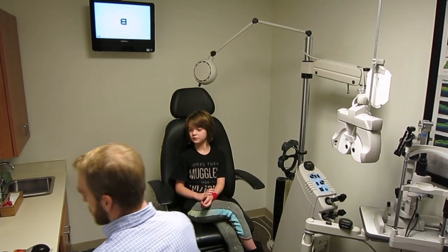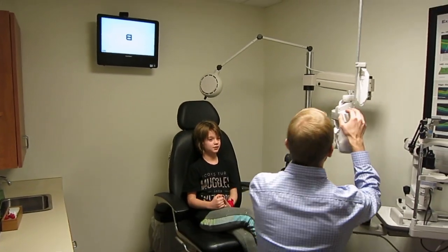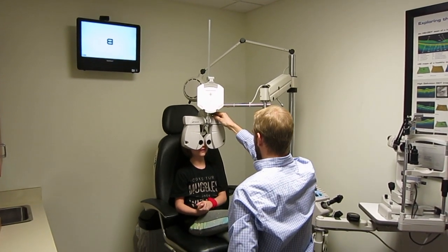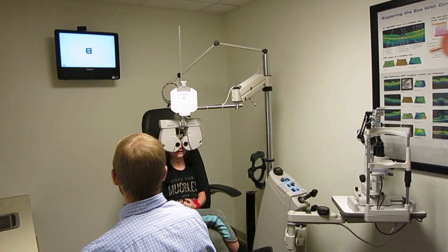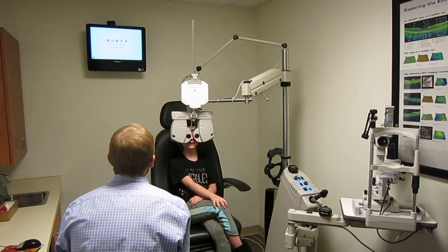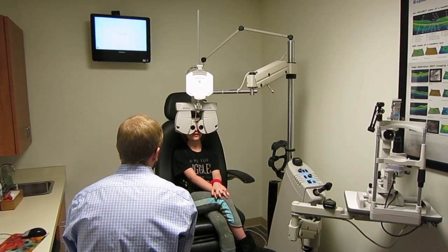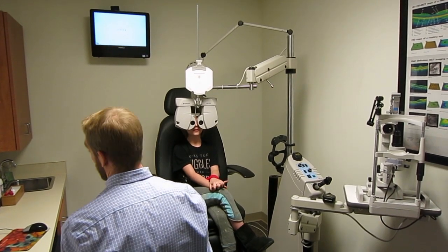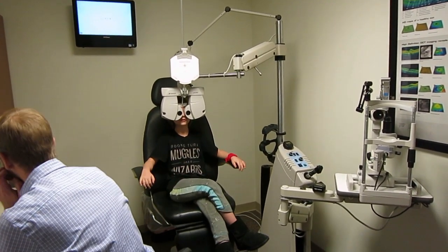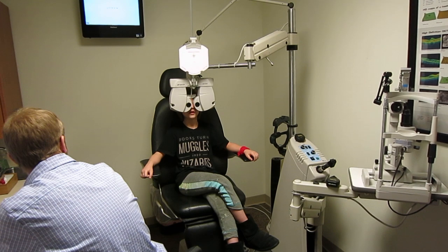Alright, the glasses part. I'll have you look at the view right now and I'm going to bring this up — I bet it's going to be clear. Even just to start. Already a lot better? Yeah! The world is clear — those are not makeup smudges on that sign. What's the lowest you can read down there? The tiny F — go ahead and read these letters: B-V-O-T-L. Good, that's the 20-20 line, so that's what we're shooting for. I'm going to give you some choices now — tell me which one's the clearest. Here's number one, or does it seem a little bit clearer when I show you two? Two is clearer for me.